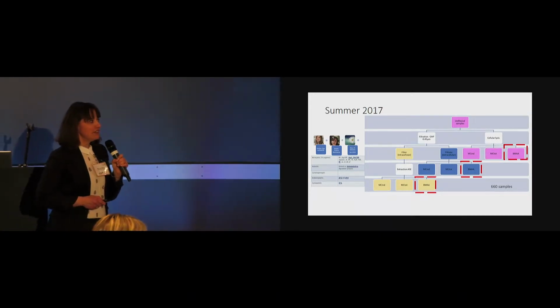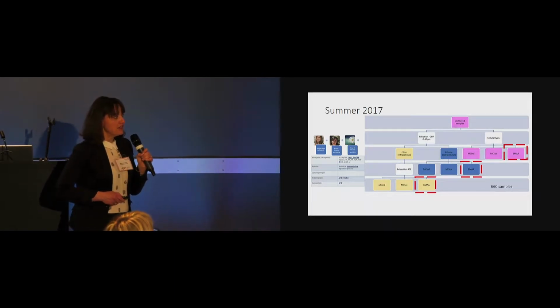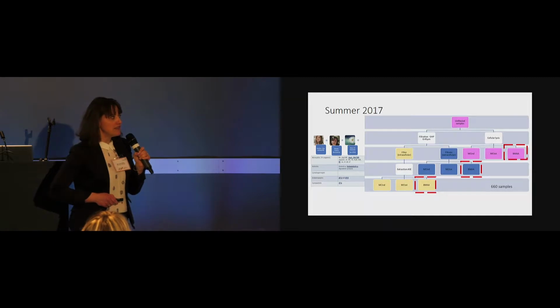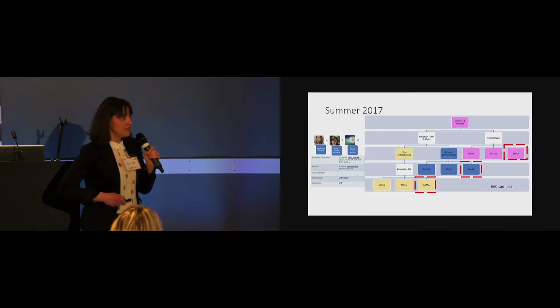In the lab, when a sample arrives, most of the time the sample is filtered, so we get the filter, where we measure the intracellular fraction, and the filtrate, where we measure the extracellular fraction. In case we get an unfiltered sample, we can do the filtration if the sample is not frozen, and then we have the filter and the filtrate. Otherwise, we proceed with analysis on the unfiltered sample. So every sample ends up having 6 analyses, because the filter is analyzed for MC individuals, MC total, and BMAA. Same thing goes for the filtrate.